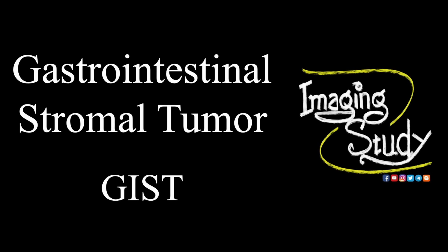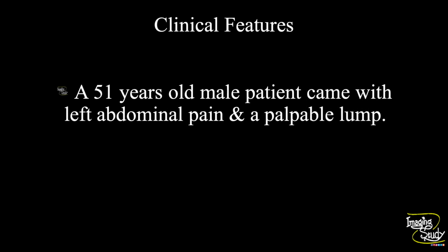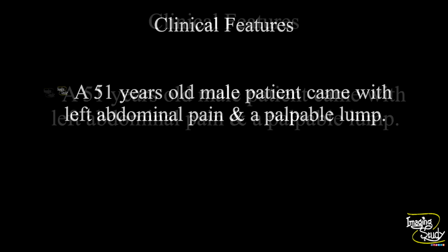Today we are going to see a case of gastrointestinal stromal tumor, in short known as GIST. A 51-year-old male patient came with left abdominal pain and a palpable lump at the lumbar region. Let's see what we have got on ultrasound.